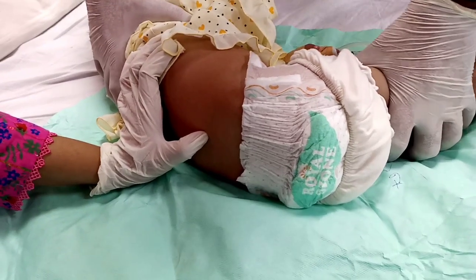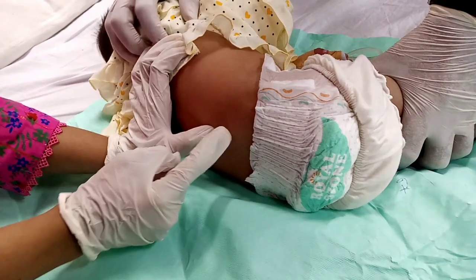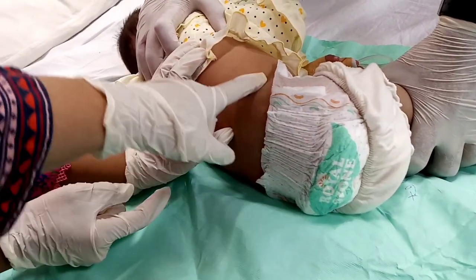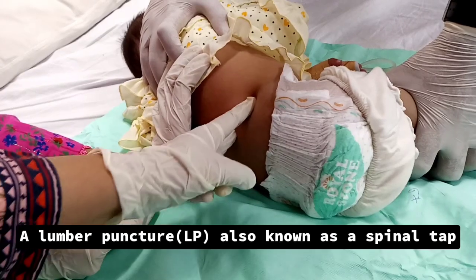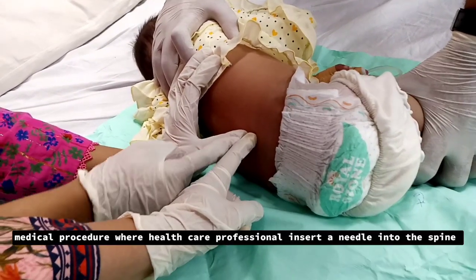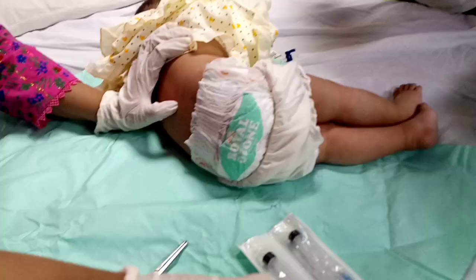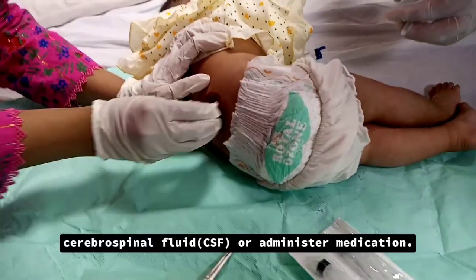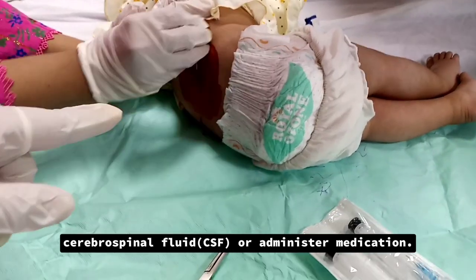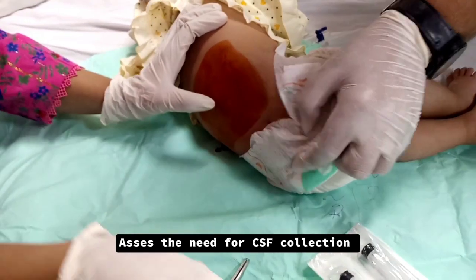Welcome to Hospital Life channel. Today we are performing a lumbar puncture. LP, also known as spinal tap, is a medical procedure where a healthcare professional inserts a needle into the spine to collect cerebrospinal fluid (CSF).